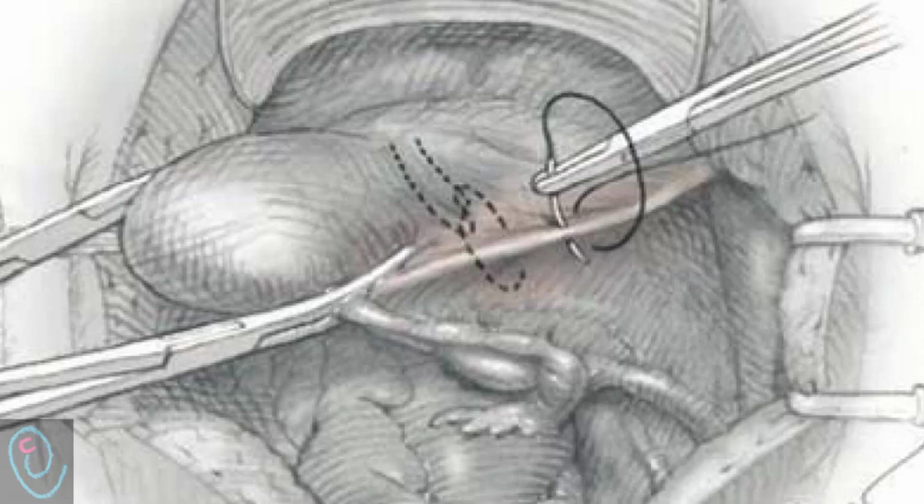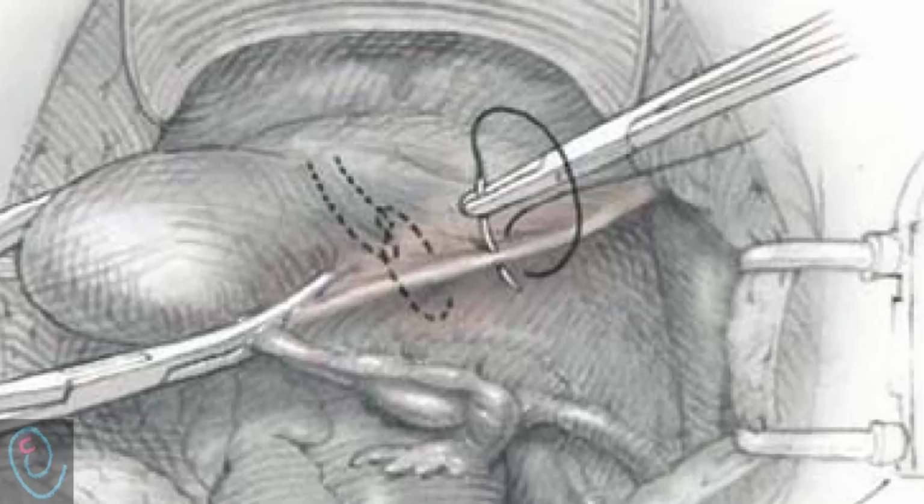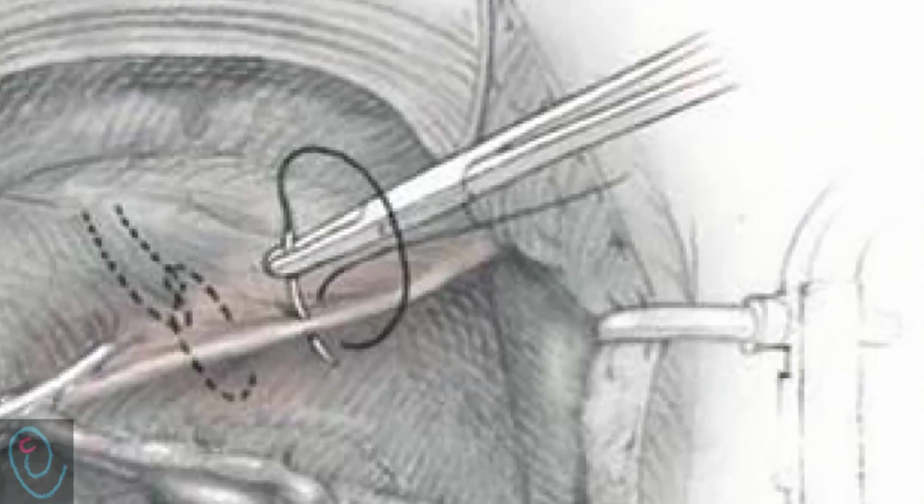The round ligament is grasped with tissue forceps and elevated. A transfixing stitch using zero delayed absorbable suture is placed about 1 cm lateral to the planned division site. The first bite passes through an avascular site of the mesosalpinx under the round ligament, while the transfixing bite pierces the round ligament, medial to the first bite. A second simple stitch is placed 1 cm medial to the first, and again through an avascular site in the mesosalpinx and under the round ligament.